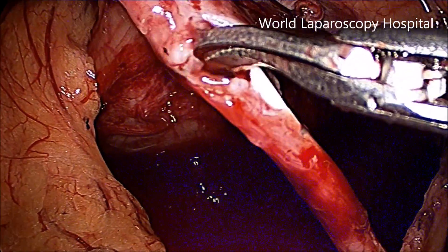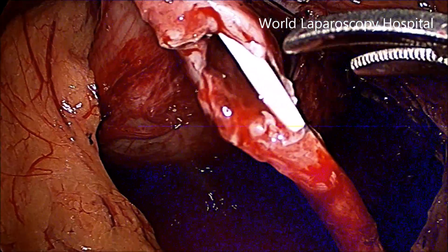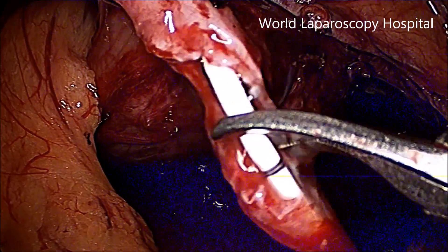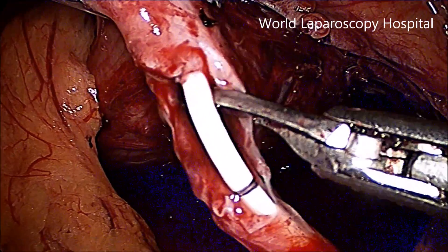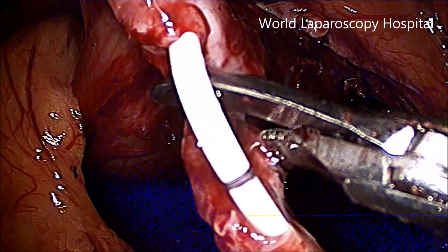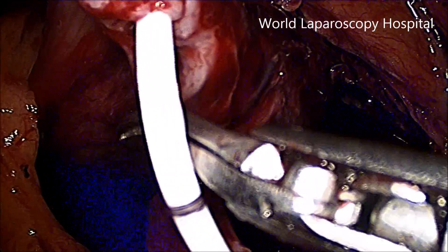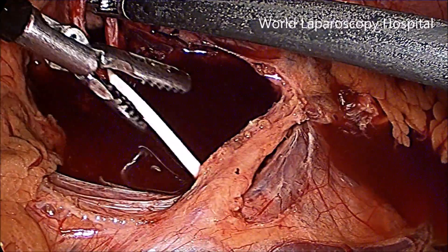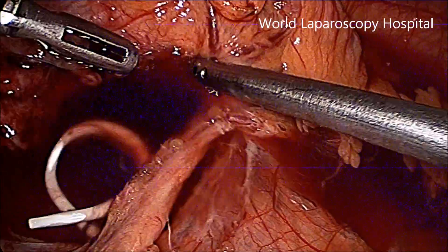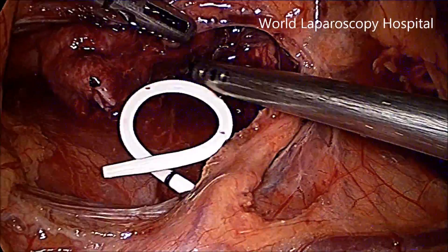Now the entire ureter is cut, taking care that it should not be a completely perpendicular cut — it should be a little oblique, so that when you do the anastomosis there will be less chance of stricture. Laparoscopic pyeloplasty actually needs good suturing skill; intracorporeal suturing should be very precise. The upper J of the DJ stent has been removed and the urine which has leaked will be sucked out; here the urine mixed with blood is present.